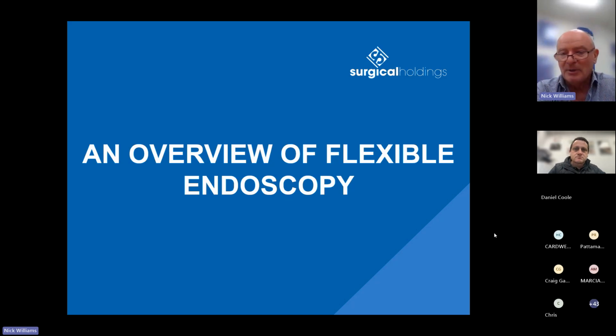Obviously, those are getting bigger, and there's certainly a lot of development in that area. The term that I always used to hear was full thickness repair, full thickness resection, in terms of taking out cancer for colorectal surgeons, for example. And I think you're going to have to increase the diameter to get that, because you really want that angulation that was shown there to start doing that sort of thing.